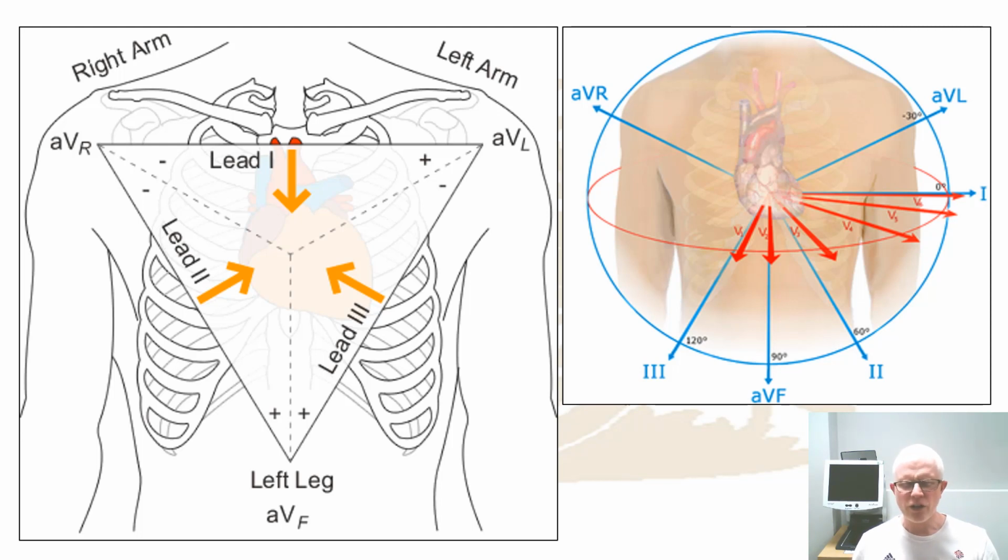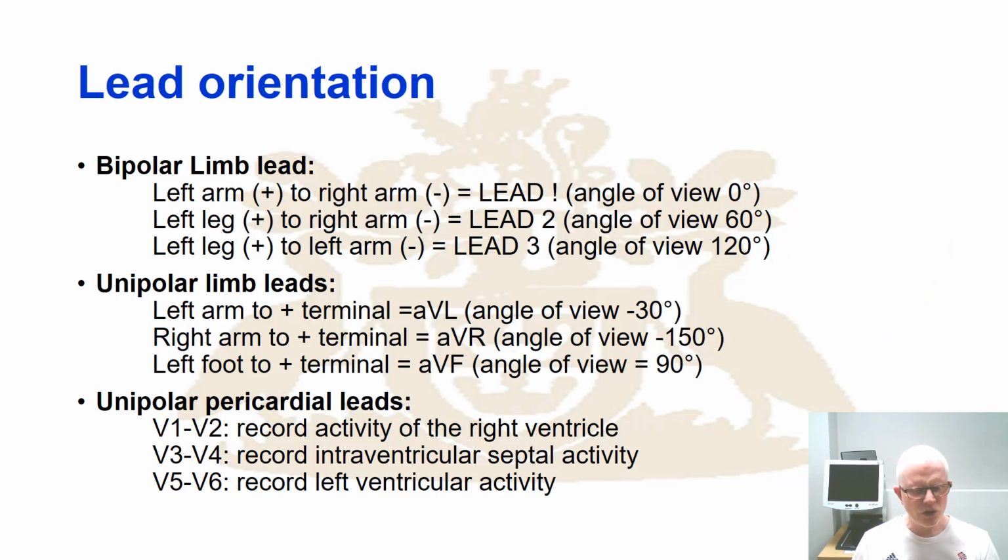And what you'll do is count those up and go, oh crikey, there are only 10 electrodes. There are only 10 electrodes, but what you've got is 12 leads. That is, you've got 12 configurations using the 10 electrodes. Remember that we're using some of these leads twice: left arm, right arm, and left foot.